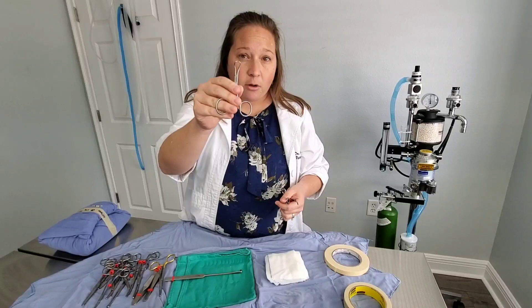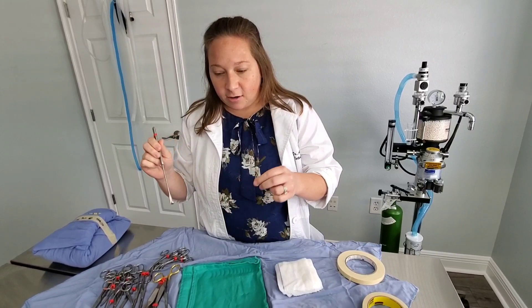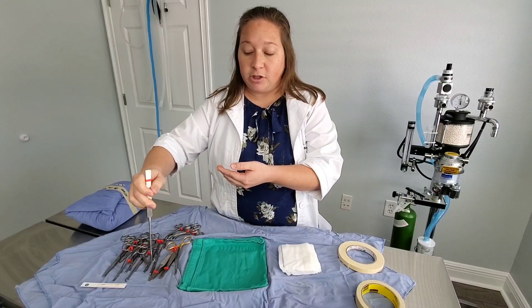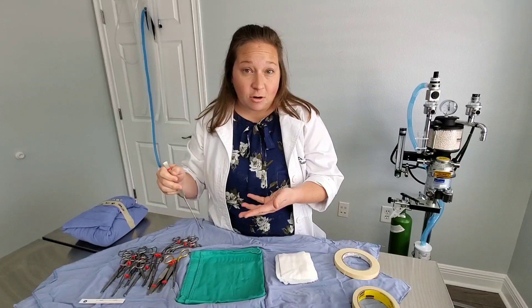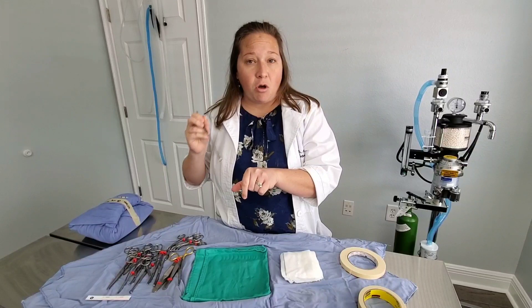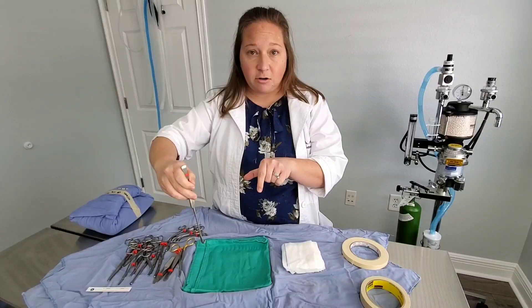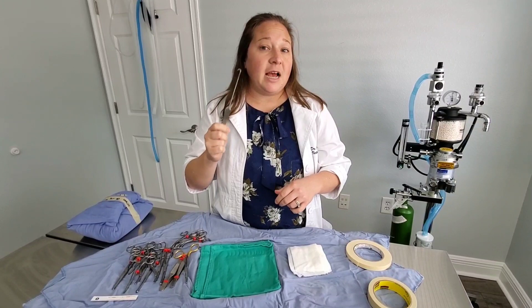The last instrument in my spay pack is called the spay hook. Basically, we make our spay incision, go in on either the left or right side, slide down the body wall away from the organs, turn the hook, scoot in, and pull up — and usually we can find the uterus that way. Sometimes uteruses are hard to find, but this is a great tool to keep our incision small and fish out the uterus. We sneak in along the body wall so we're not hurting any organs, turn the hook to face the interior, and pull up.